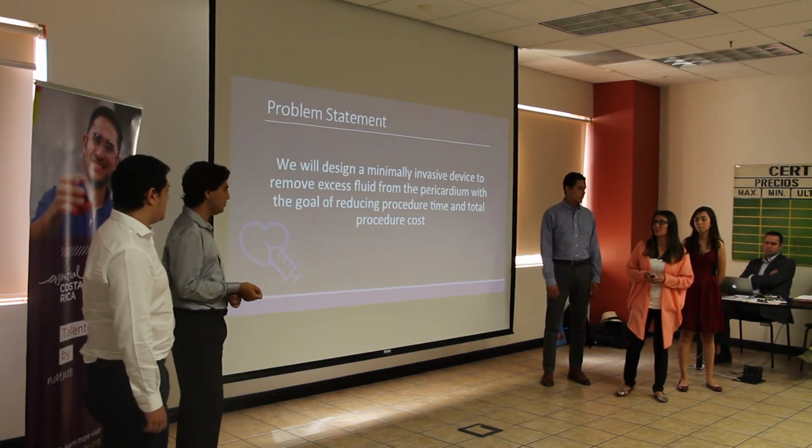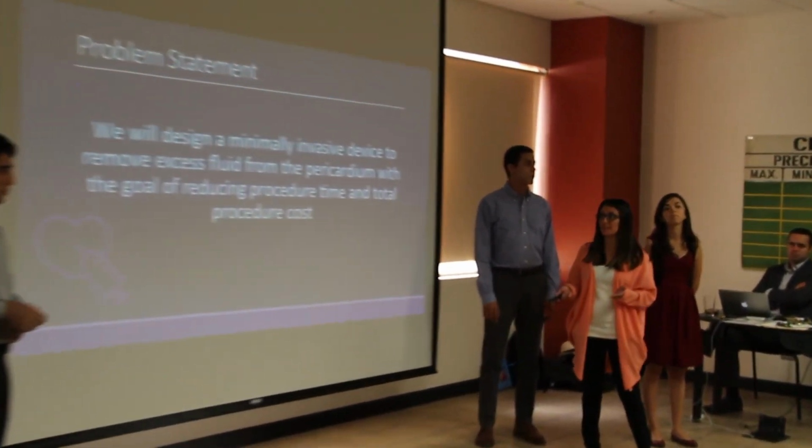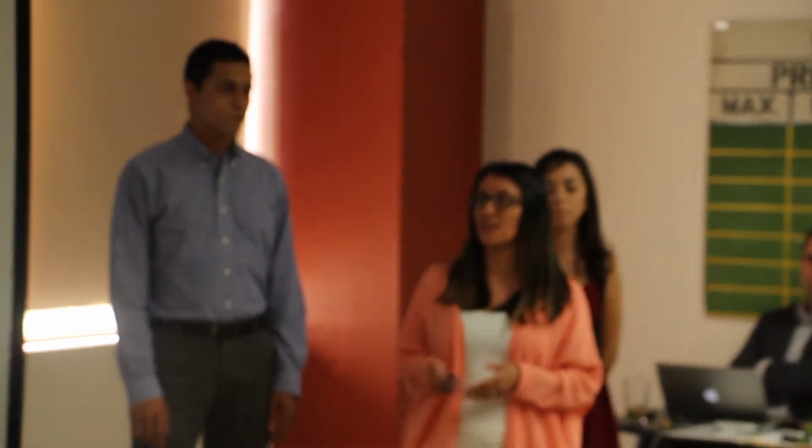Well, so we define our problem statement, as you can see, is that we will design a minimally invasive device to remove excess fluid from the pericardium, with the goal of reducing the procedure time and also the total cost of this device.